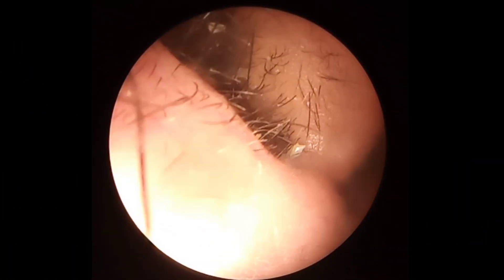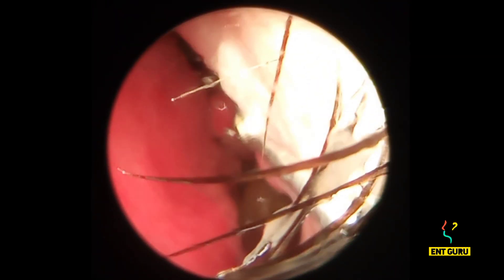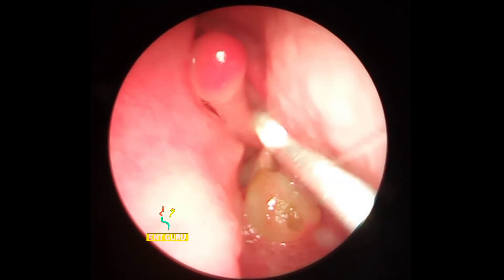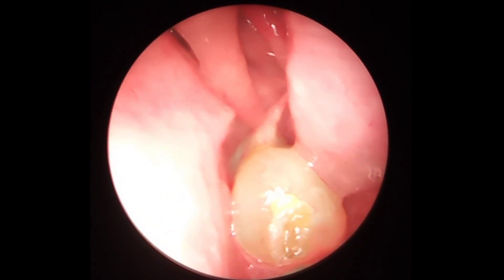I have a young patient with unilateral nasal blockade for months and months. I want to do an endoscopic examination under local anesthesia and saw a mass in the nose. I use a Jobson Horne probe with a ring curette side for probing, and you can see this is an insensate soft mass in front of me.